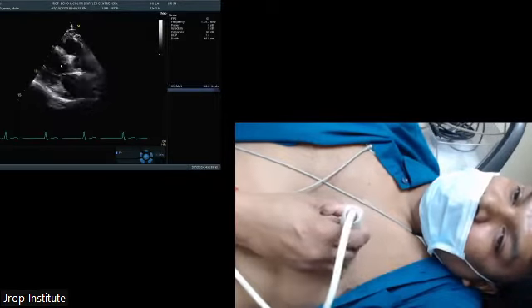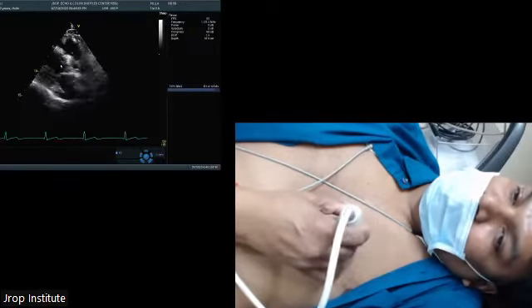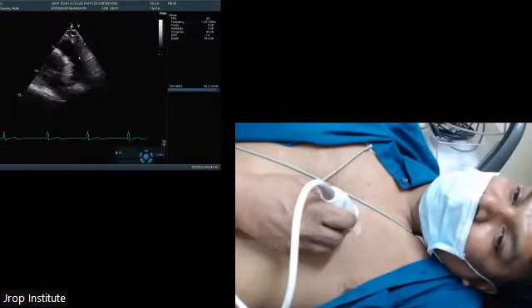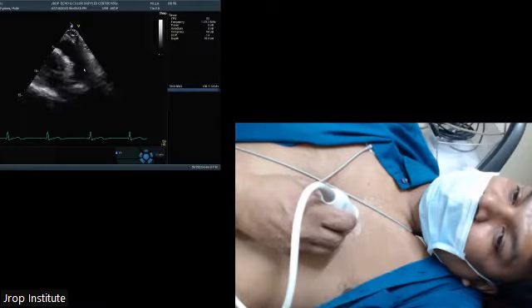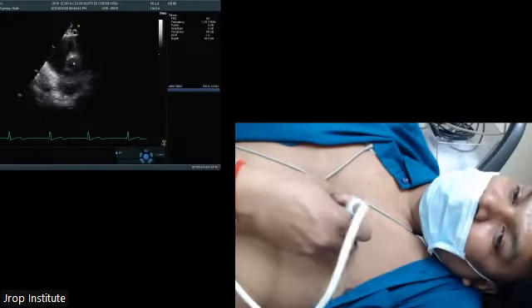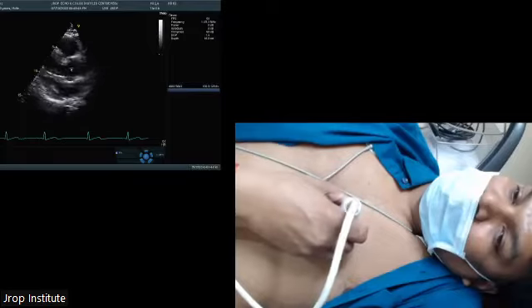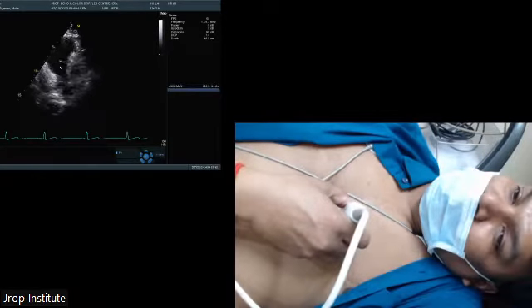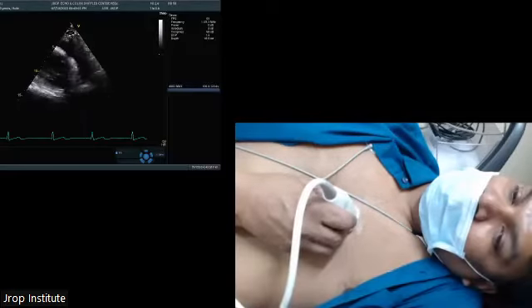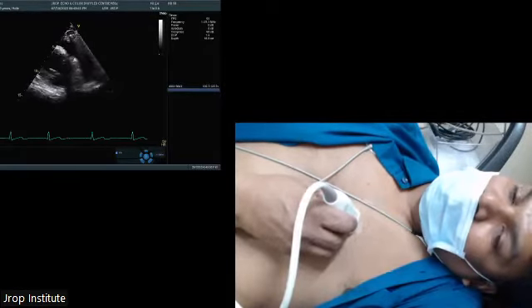Somebody asked me this question. If I tilt to the opposite side, look, if I tilt to the opposite side, what I'm going to get is the pulmonic artery and the RVOT outflow view. Look at the transducer and look at the views. This is the parasternal window; mediastinum tilt of the footprint gives the RV inflow view. Left shoulder tilt will give you the RVOT view.